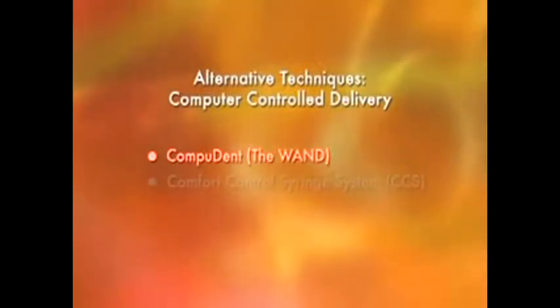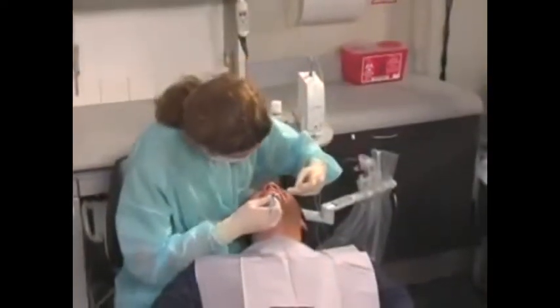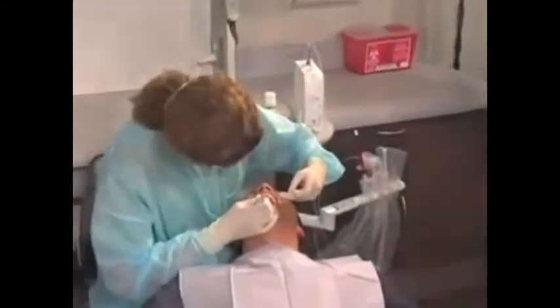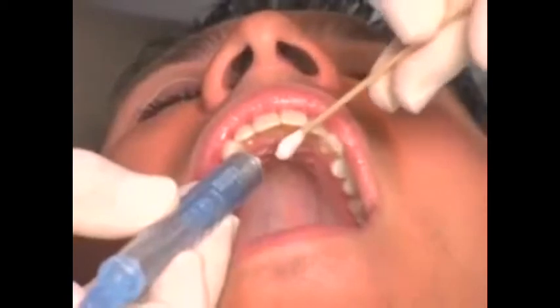The Compudent wand delivers anesthesia at 2 rates, slow and slower. At the slowest rate, a full cartridge is administered in 4 minutes. This rate is used in palatal injections, intraosseous injections, and the PDL. The faster rate deposits a full cartridge over 60 seconds and is used for other anesthetic techniques.